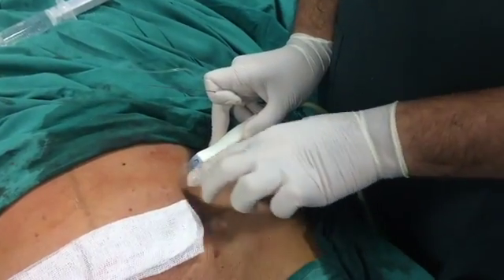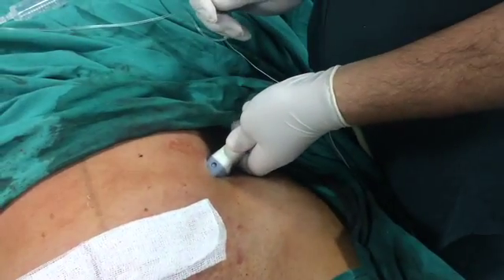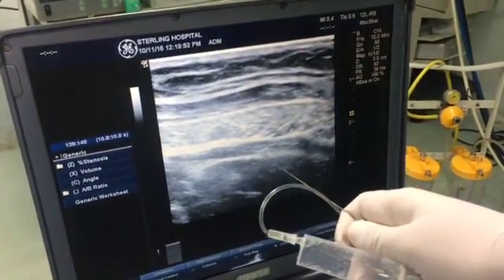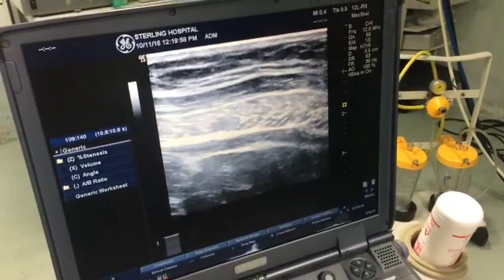So I have started the scanning. I am just above the iliac crest in the mid-axillary line — it is 5 cm above and lateral to the anterior superior iliac spine. Here you can see 3 muscle layers: external oblique, internal oblique, and transverse abdominis. I am targeting the plane between internal oblique and transverse abdominis, where both nerves lie.